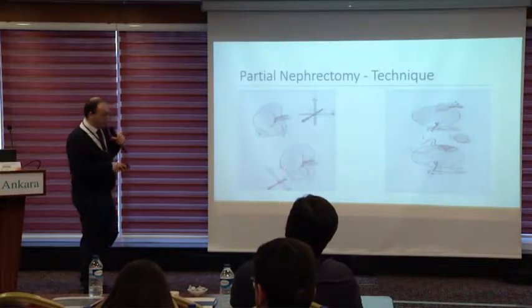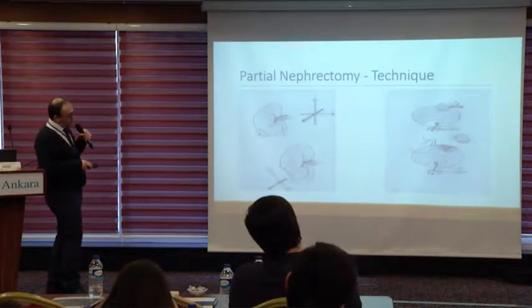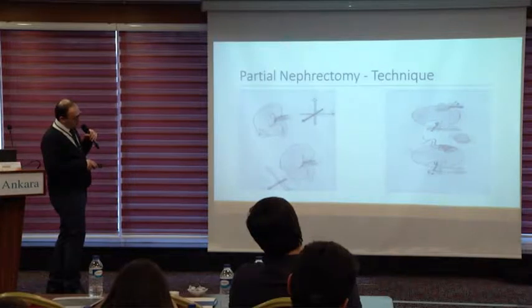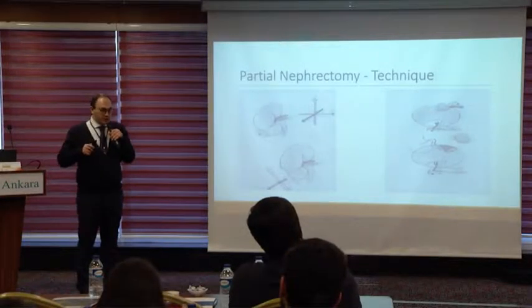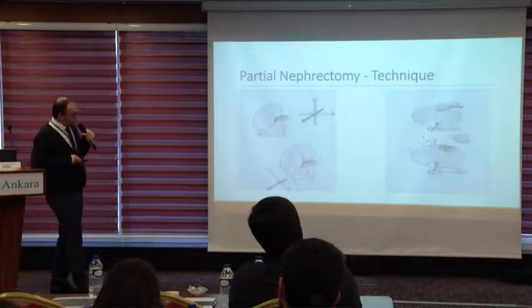Then my aim is getting my needle forward to a point in the x-axis and to another point in the y-axis. Therefore, never make your needle holder move in both dimensions. Okay, put your needle in here.